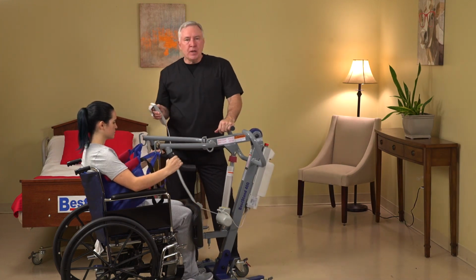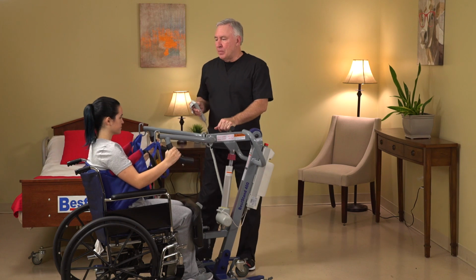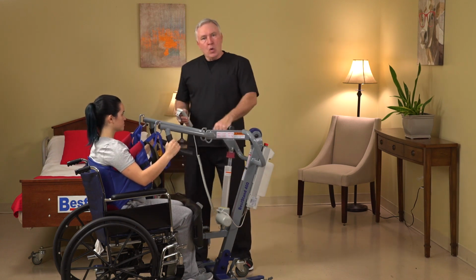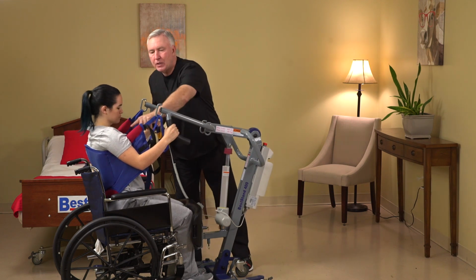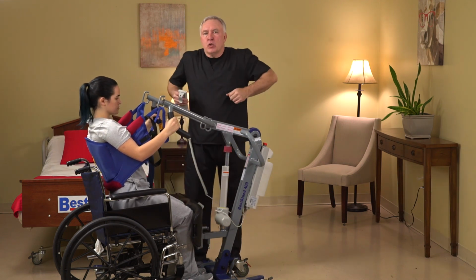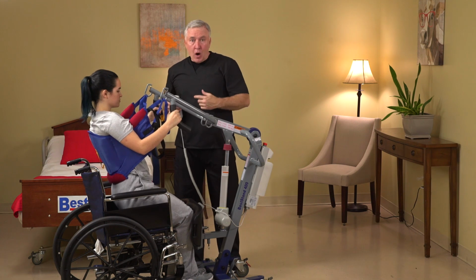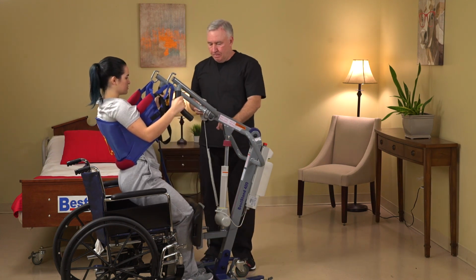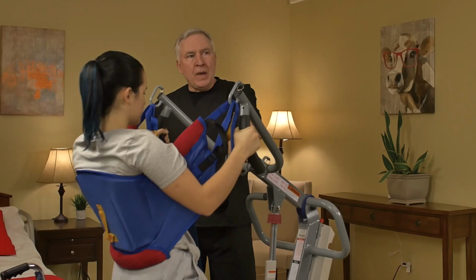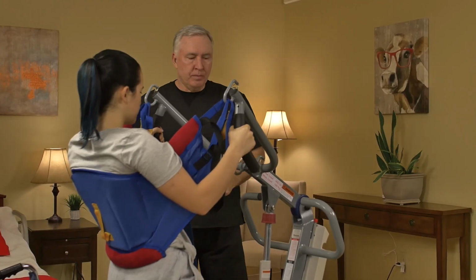And now hit the up button to raise the patient up from the sitting to the standing position. While the patient is being raised up into the sitting to standing position, we always want to pay attention to the shoulder area. Make sure those shoulders aren't raising up, because if they are, the sling is pulling under their arms, not resting behind their back. We can get the patient completely standing or semi-standing.